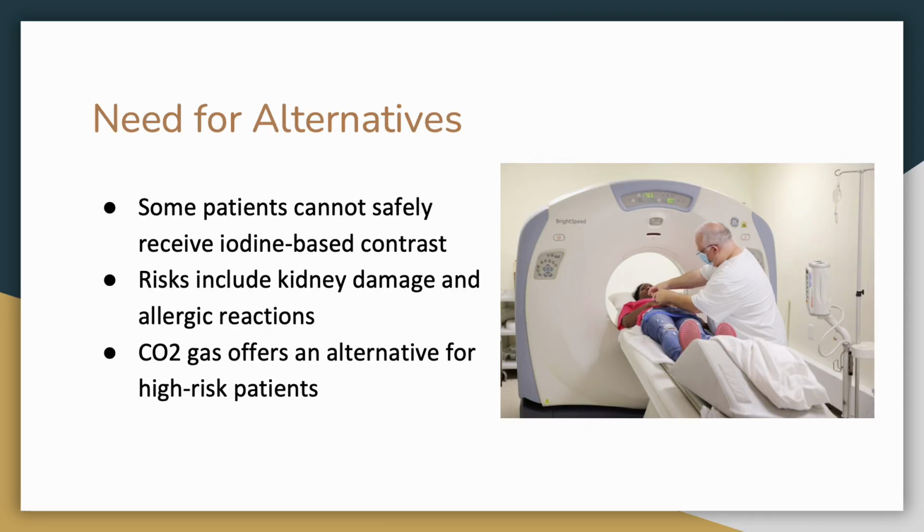Carbon dioxide is recommended for patients with allergies to iodinated contrast, also those that may be in the late stages or have chronic kidney disease, and those on dialysis. The need for these alternatives would be: one, the patient has an allergy, or they have low kidney function. And carbon dioxide gas offers an alternative for these high-risk patients.